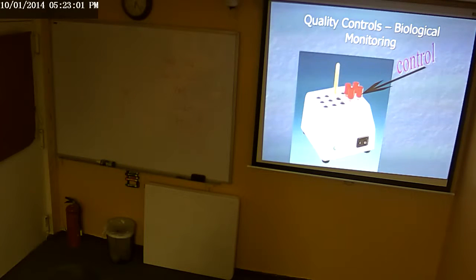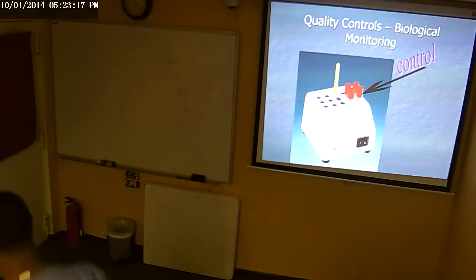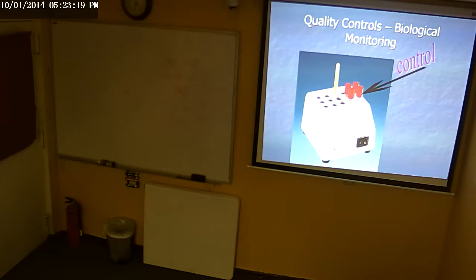Alright. The control is testing now. It's testing, so the machine is working. It's testing whether the BI is alive. It's not dead. Yes, alive. Yes, that's the control. And the machine is also working properly.